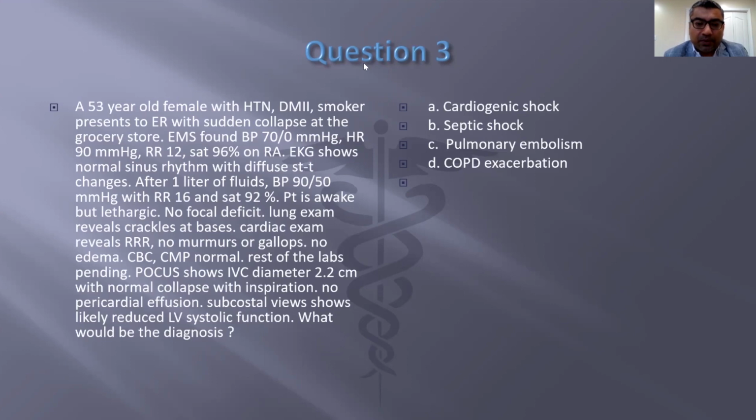And then what would you measure on echo? Is TAPSE enough? I don't think TAPSE is enough, for many reasons. One is TAPSE can be normal in pulmonary embolism because the right ventricle is mainly a longitudinal wave, and then you can have the base and the apex very hypercontractile and the free wall very weak. And that's the McConnell sign to diagnose pulmonary embolism.